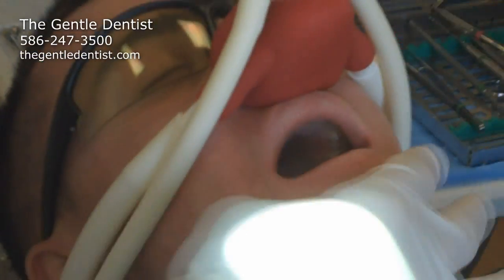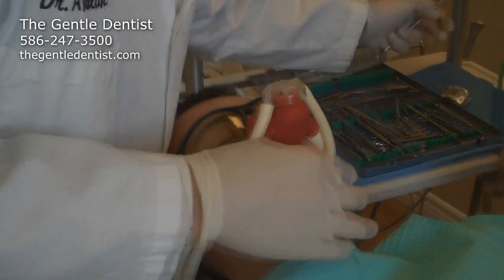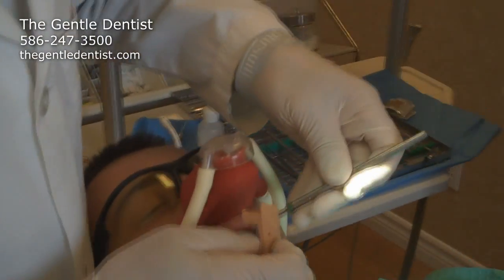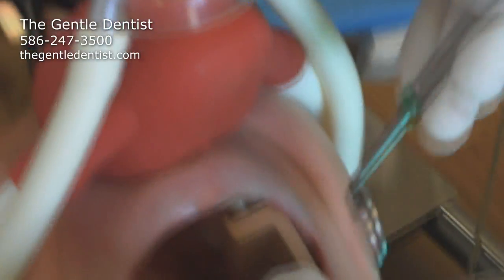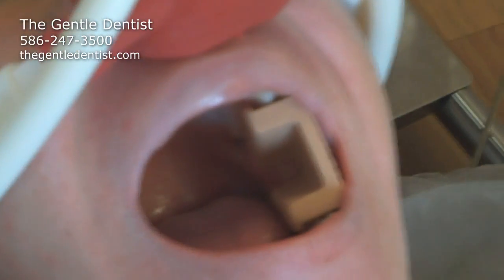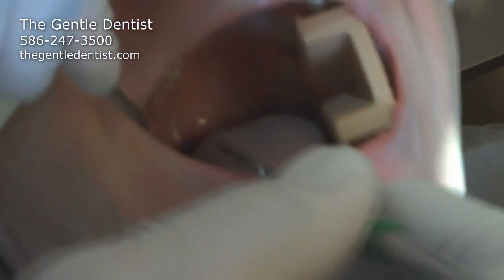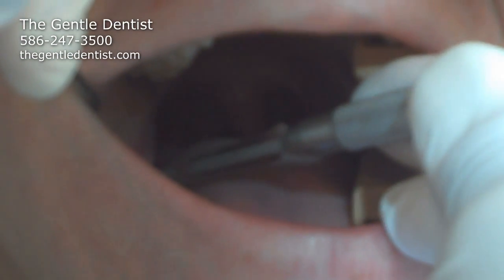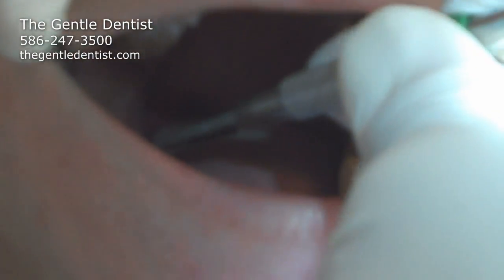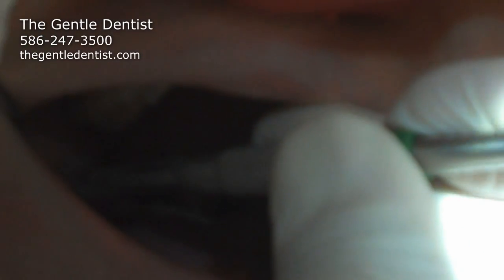You're completely numb? Your lip feels real fat, Marshall? Yes? Okay. So I use what's called a bite block. That's going to help him open real big for me. What that's going to do is help to stabilize his lower jaw. And a 15 blade. Okay, Marshall, open up wide, please. We're going to create an incision here. Marshall, just raise your hand if you need me to stop, okay, bud? Right now we're just going to create a little incision here so we gain access to it.